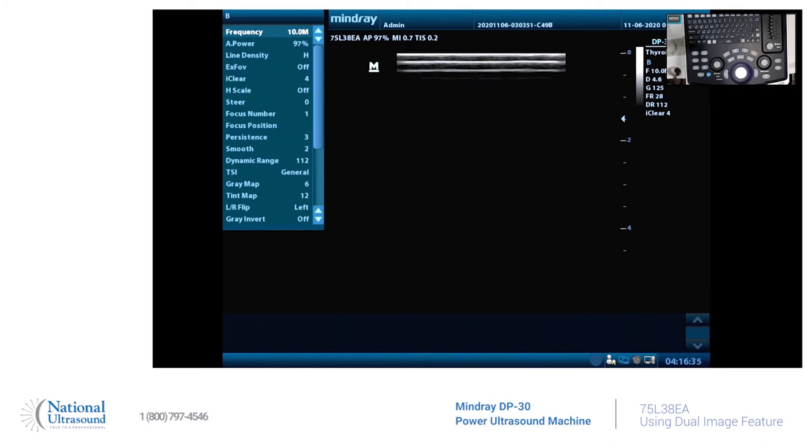Let's pretend my thyroid is too big to fit on one single focused image. To increase the field of view — still can't fit it in. So we're going to hit dual screen. There we go, there's two.